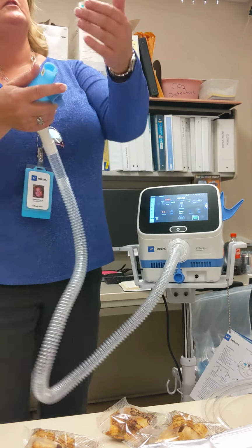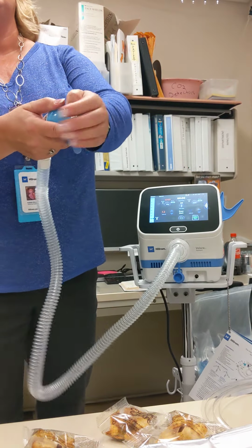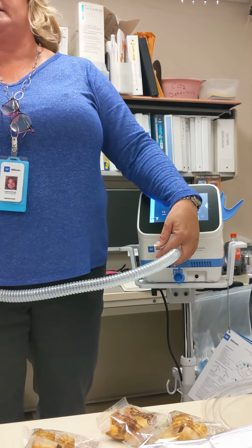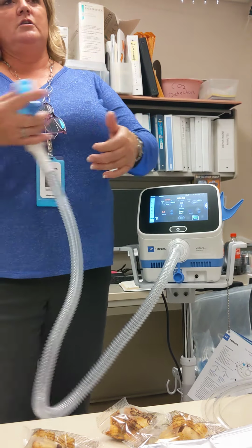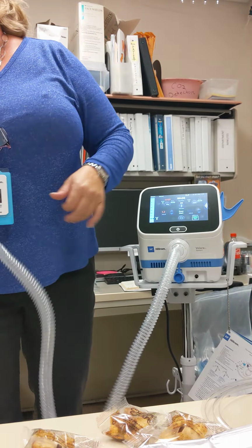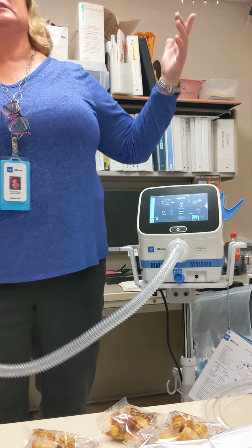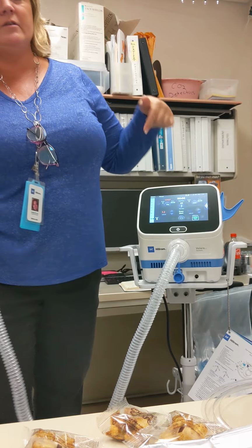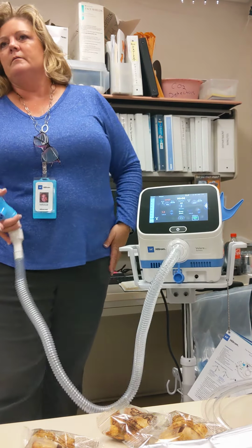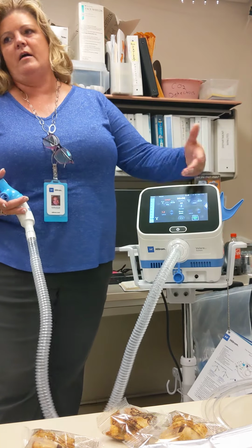Because some people, if you turn it off while it's in line, what did you just do? De-recruit. Because now you have another limb, but it's trying to get air to it. So you just pull it off. You'll hear the ramping go up, then you can hit off. It just gets loud. You'll hear the blower, and after a couple minutes, it will turn off.